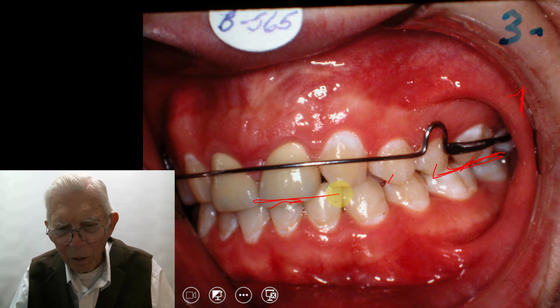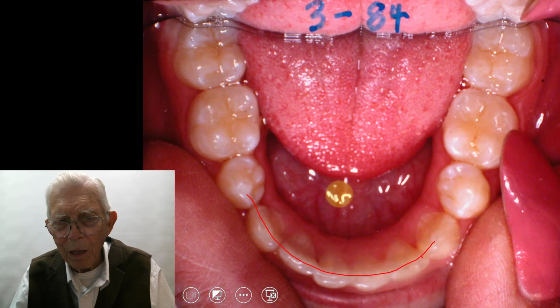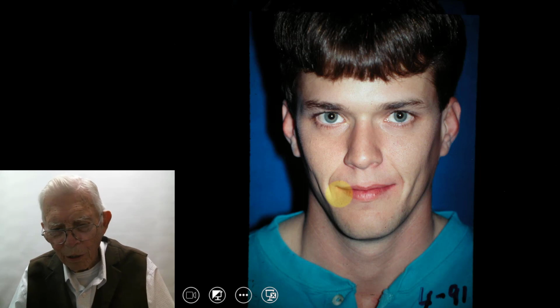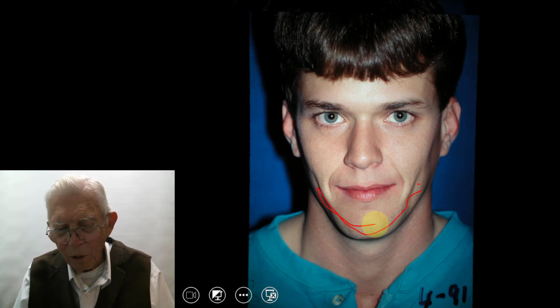So let's go on now and see what happened. All right, this is 84, and everything's looking pretty good. And this is 1991. So from 84 to 91, that's 7 years, I believe. And you look at this, and this young man's lower jaw grew out some, like a lot of young men's jaws do, and they can do that up to, say, 21 or 22.